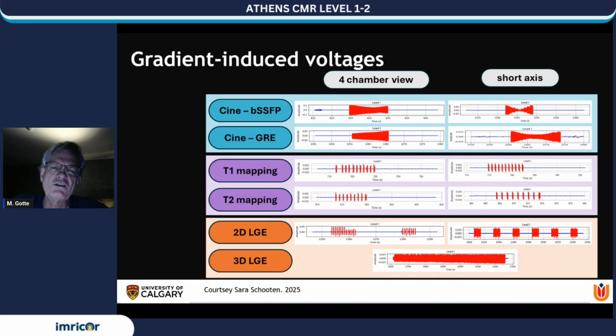So this is knowledge you can obtain prior to scanning. You can incorporate this in your filter strategy, and for that reason, you will be able to improve the EKG quality. This is again important for electrophysiologists and important for doing more risky procedures.